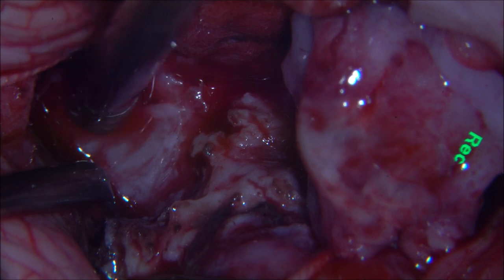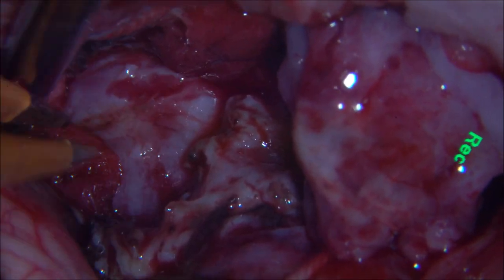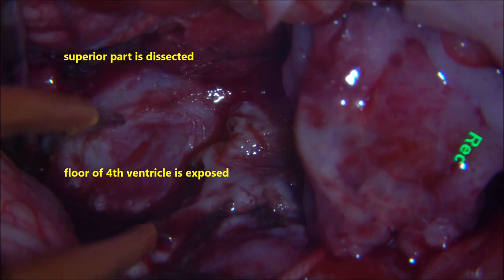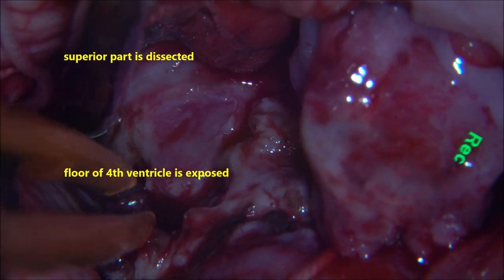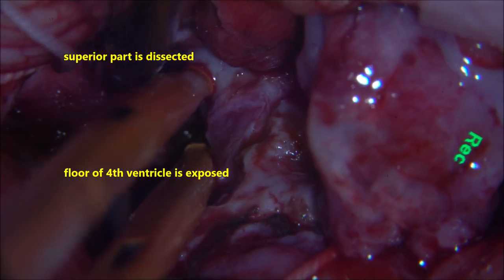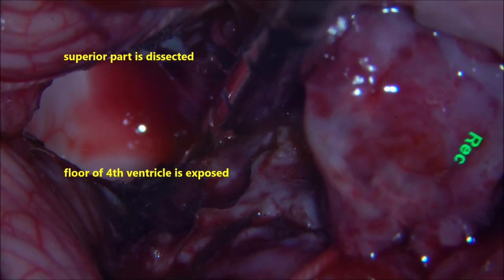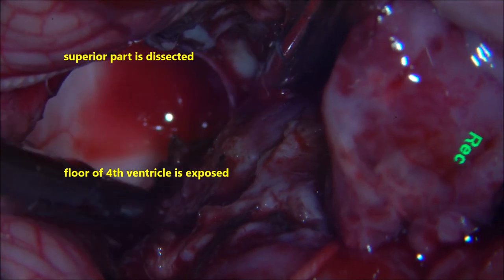There may be some bleeding, for which wet cottonoids are placed and bleeding usually stops. In a child of one and a half years, one must always monitor blood loss and keep transfusing. We prefer to give blood transfusion from the outset. We don't give fluids — we start blood from the initiation of surgery so that whatever the child has lost is always replaced, and the child will not go into hypotension.